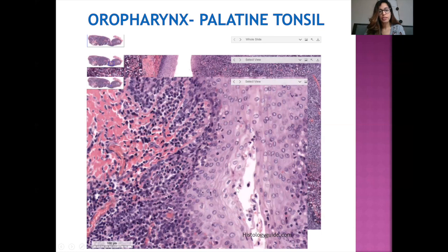And if we go a little higher, you can actually see that the lymphocytes are intermingled with the squamous mucosa. So not only are they present in the epithelium, there's quite a bit of intermingling between the lymphocytes and the squamous mucosa. At the ultrastructural level, this causes small breaks in the basement membrane of the squamous mucosa as these lymphocytes perforate through in multiple areas.